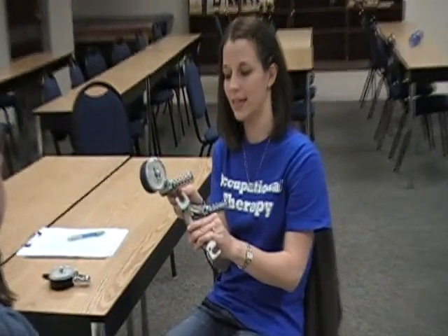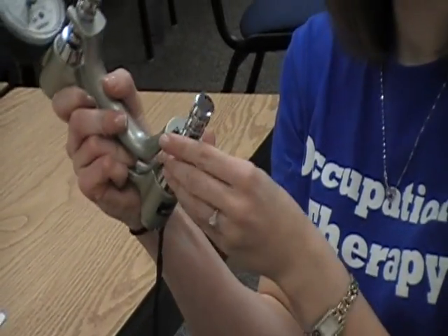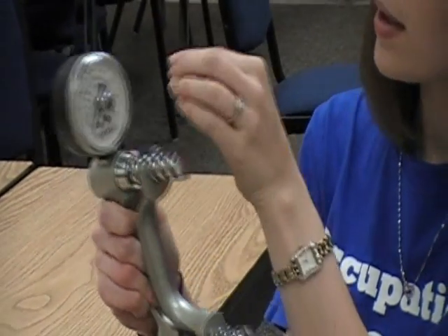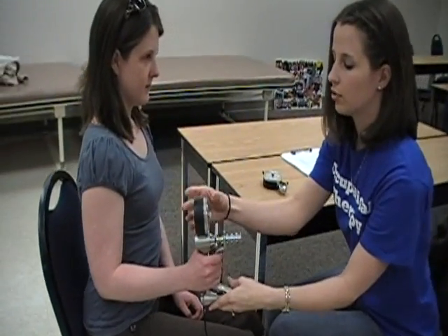As a therapist, we will put the clip on the second rung and make sure that this knot is turned to zero. We'll position the client with shoulder neutral, elbow flexed to 90 degrees, and forearm and wrist in neutral.